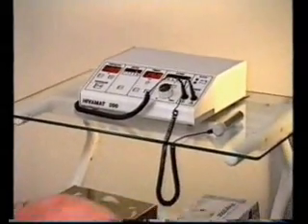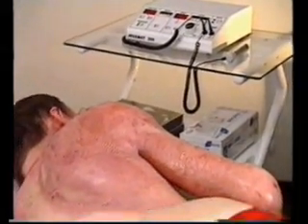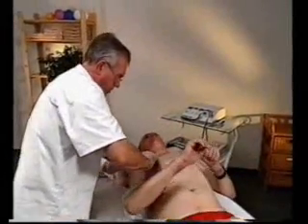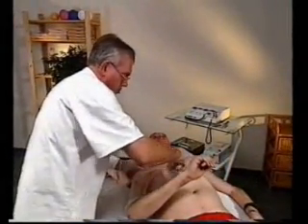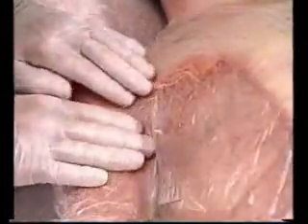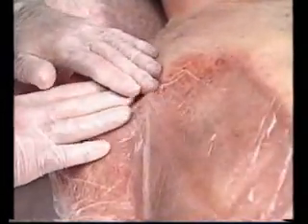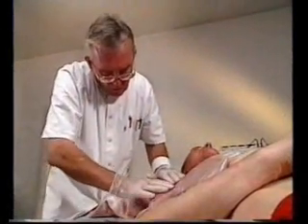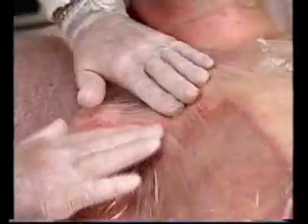In case of thermal tissue lesions, as this large-size burn, therapy with the Hivamat 200 offers similar advantages. For protection of the wound area, treatment is performed through a special surgical foil. The treatment accelerates the removal of burn toxins, provides a faster immunological activation and an enormous trophic improvement, and enhances granulation. At the same time, there are no cicatricial contractions.